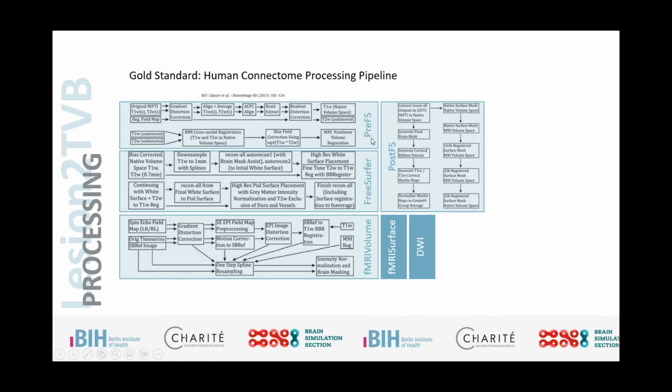So we're starting here with the PreFreeSurfer part of the structural pipeline, then the FreeSurfer, which is the surface extraction itself, based on the recon-all algorithm, again performed multiple times. So even on an HPC environment, if we're talking about, for example, a 20-core call to this, we can still end up with 15 to 20 hours of pure processing time for a single subject.